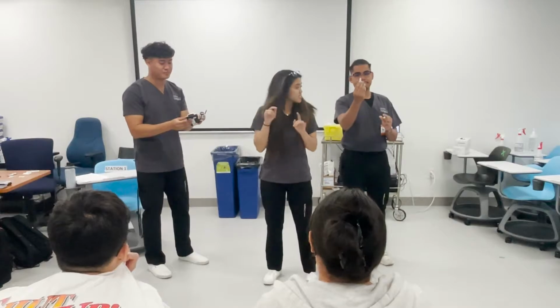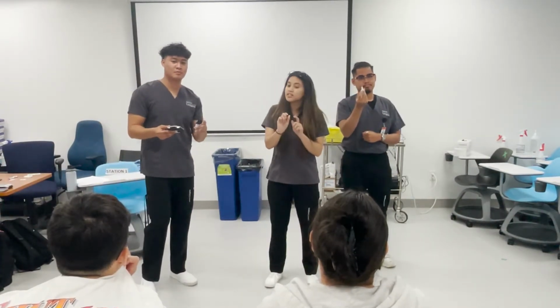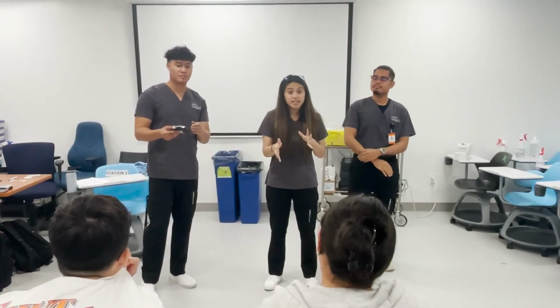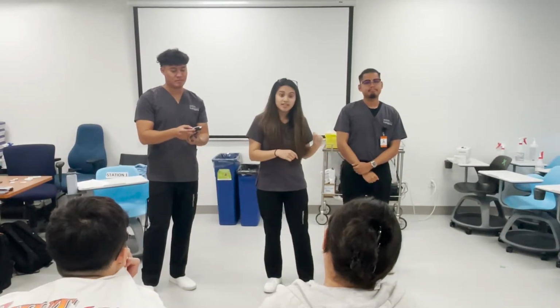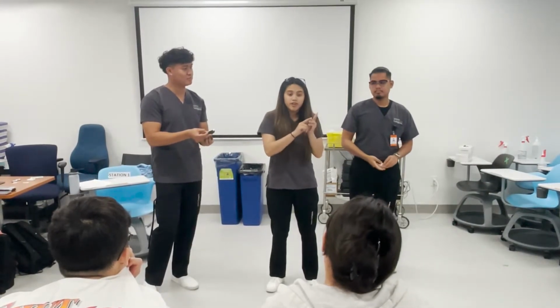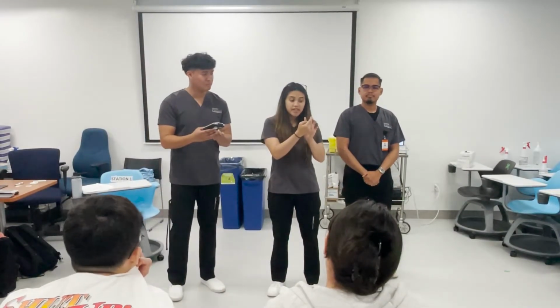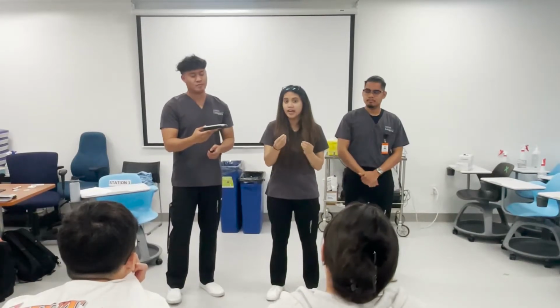For us, it looks like this, but for you, it might be inside of a pen, and it might look different and disposable each time. So if you brought it today, we can go over it one-on-one, but for now, we're going to be using the lancets. And you're just gonna prick your finger right on the side of your finger, not on the very front of it. Otherwise, you're constantly gonna be touching things and introducing bacteria, right?